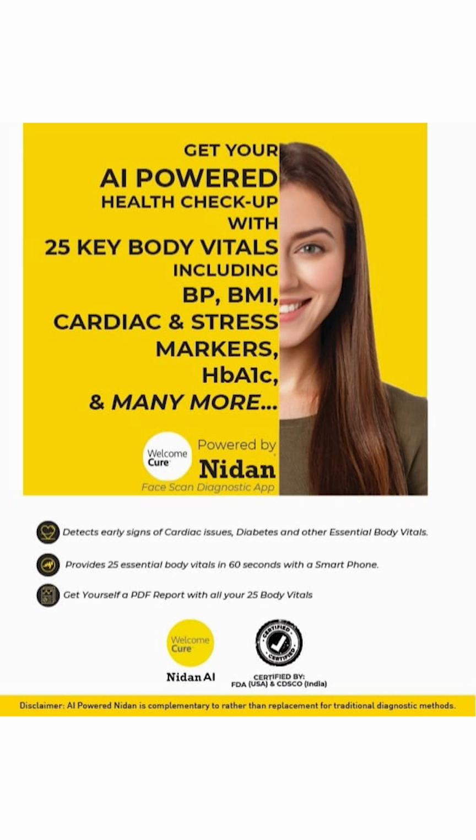Dear doctors, with this video, we aim to give you a quick and handy demo of how to use the Nidan AI tool to get your patients to use the 25 body vitals facial scan test, which is going to be now available in your clinic. This demo is a step-by-step guide on how to use it, how to benefit the patients, and how to grow your clinical practice and income. We hope that you benefit from this video, and we are happy to take any personalized calls to provide live demos and live training for this simple to use tool.